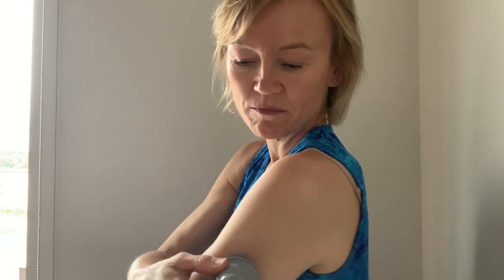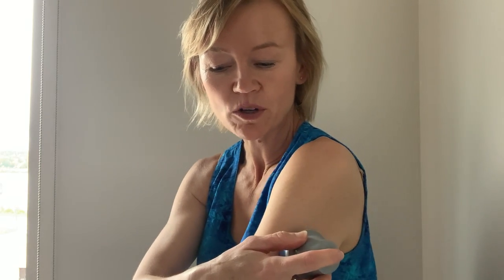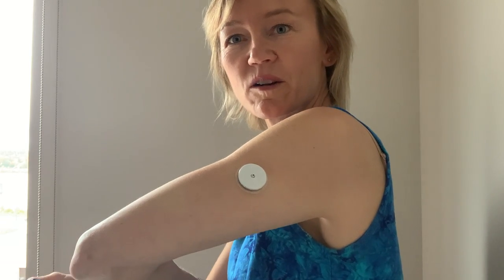I'm going to pull the device out, then I'm going to put it here just on the back of my arm, and then I'm going to simply push down. And there we go — there we have it.